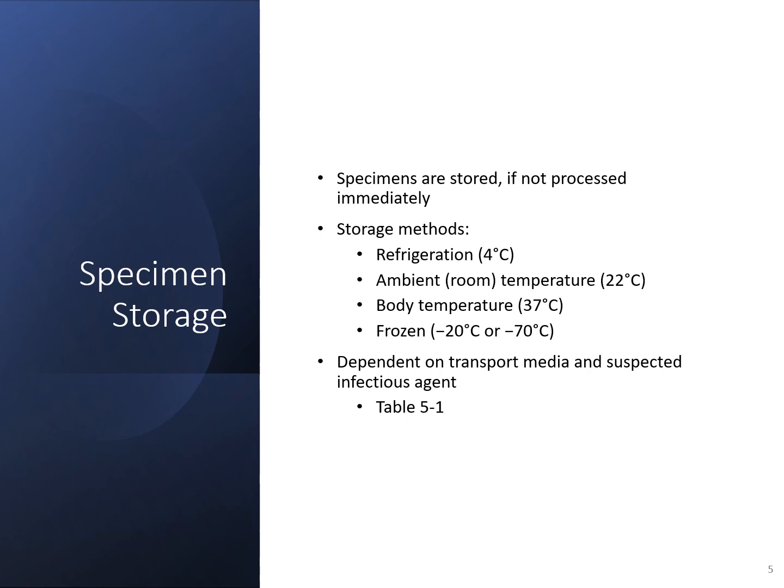Specimens that are not processed immediately can be stored, and the temperature will depend on the particular specimen and what organisms you're looking for. A lot of it will also depend on whether transport media is involved. There is a chart in the book, table 5-1, that lists various specimens and the storage requirement or the transport media that's acceptable for that particular specimen.